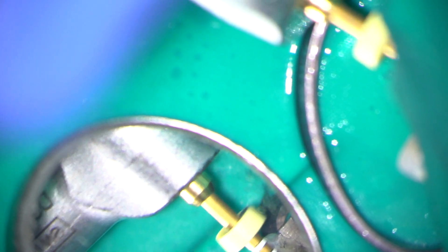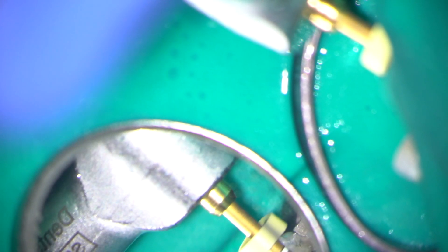The canals were all prepared and tapered using the Wave One Gold system. You have to be careful not to accidentally enter the perforation site.